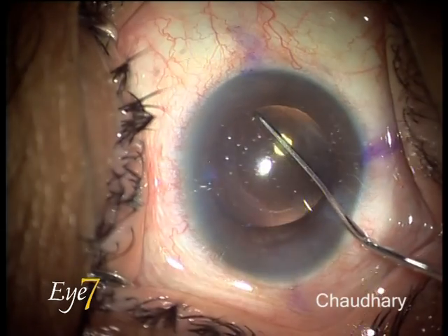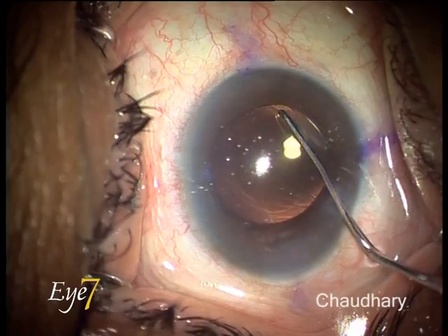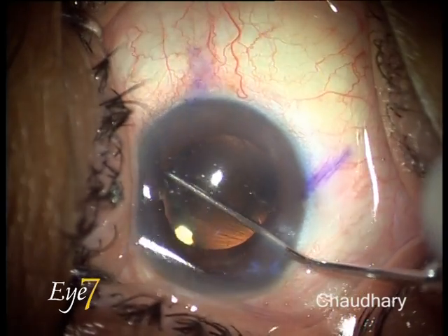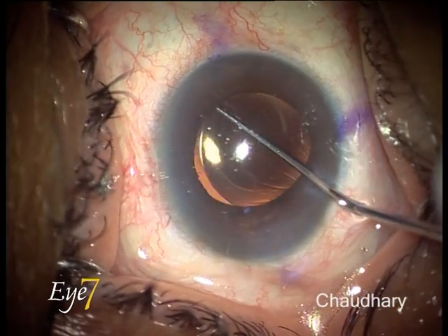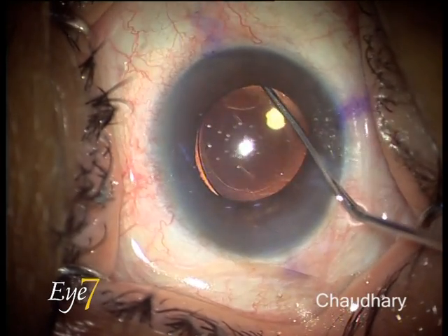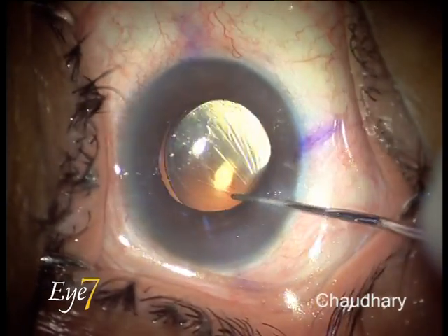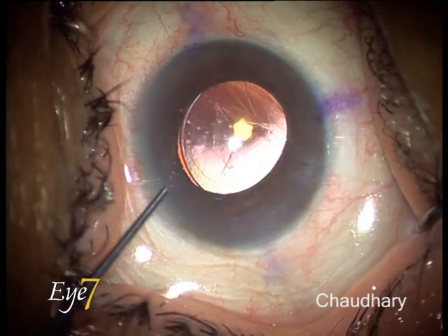I am going in with a lens dialer and I am trying to locate the optic-haptic junction so that I can engage my dialer there and try to dial the lens. I can just move the lens, but there are no signs of dialing — probably the lens is fairly adherent to the capsular bag.